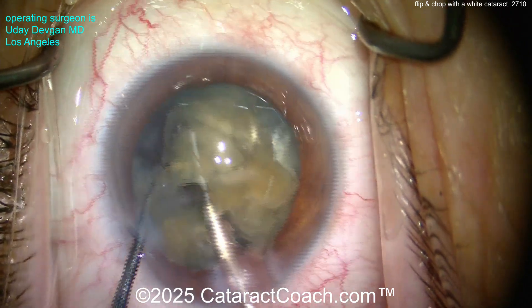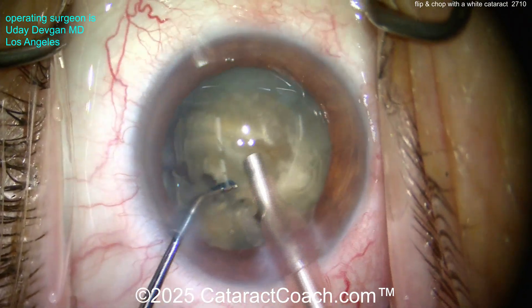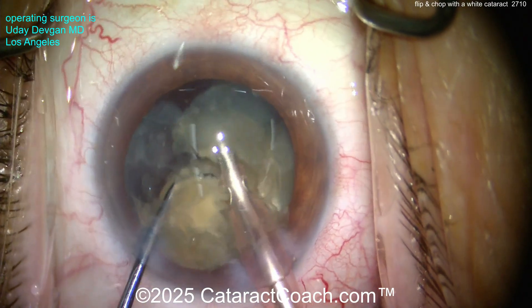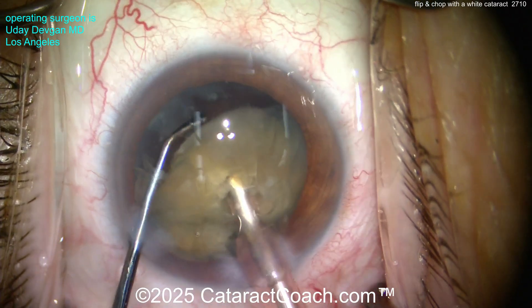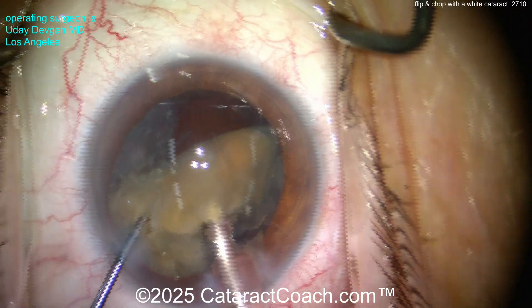Once you have a bunch of small fragments, we can take our time and emulsify them — they come out of the eye very easily. We're not riding up against the corneal endothelium; we're operating at about the iris plane and aiming down toward the capsular bag. Buzz in the nucleus, chopper goes around — and the advantage here is this gives you direct access to that posterior plate of the nucleus.